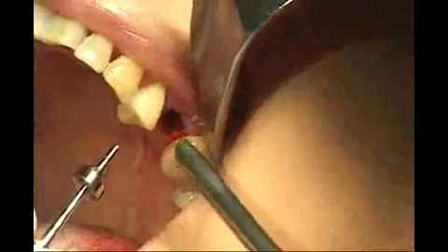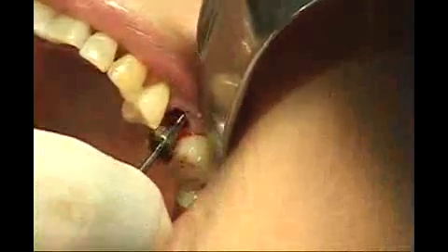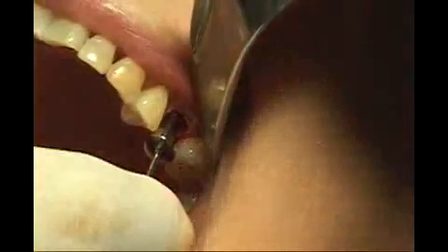Suction right on top. You want to suction the blood out of the implant, or what will happen is it'll be hard to get the healing abutment or the cover screw off sometimes.